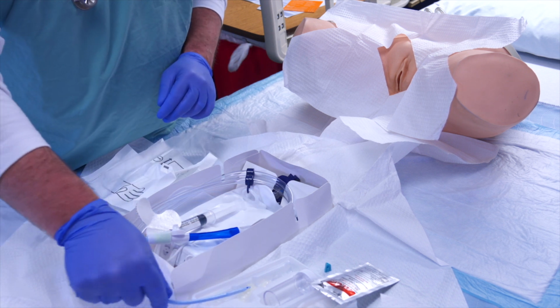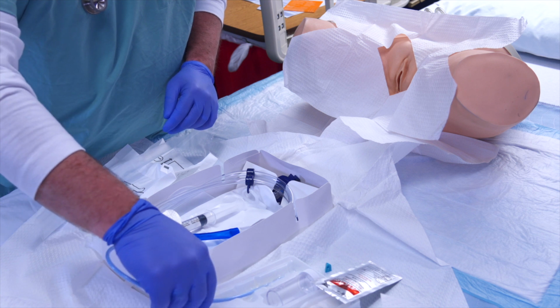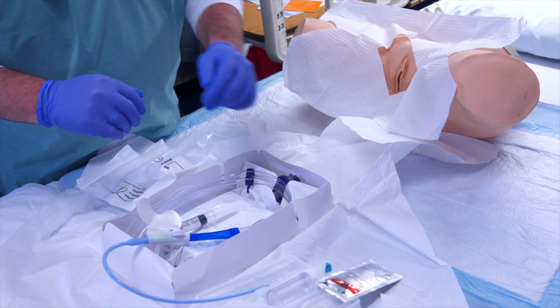Now place the catheter tip into the lubrication jelly. Roll the catheter and coat approximately 3 inches of the catheter tip. Keep the catheter tip in lubricant and tray.